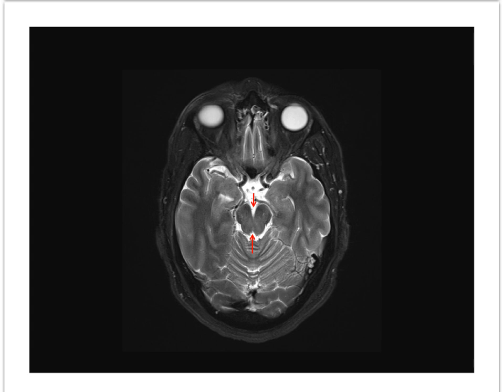Here is the rostral portion of the 4th ventricle tapering to the cerebral aqueduct, which is the narrowest part of the ventricular system. These are the ambient cisterns along the lateral aspect of the midbrain. On either side of the suprasellar cistern lies the uncus, and posterior to the uncus on each side is the hippocampal formation, seen better on parasagittal images through the temporal lobe.